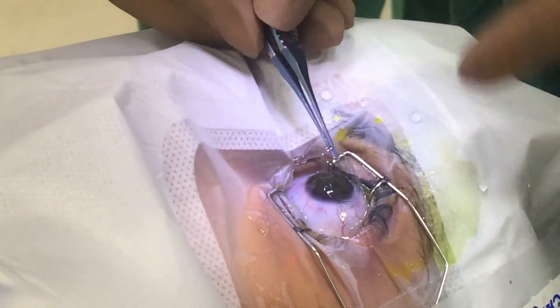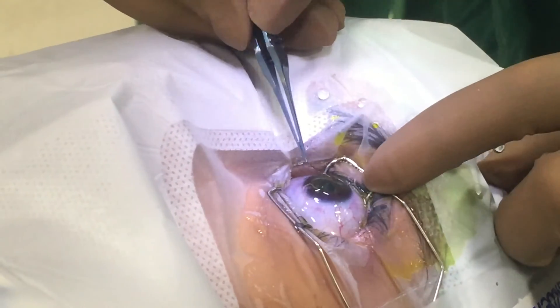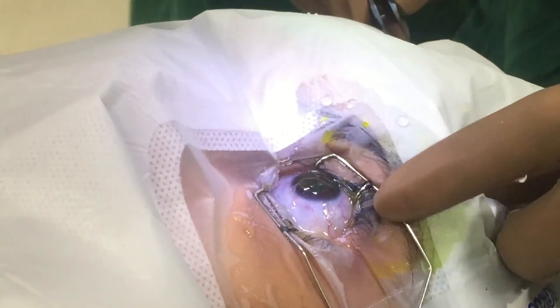For the epithelium to heal, we place a bandage contact lens over the eye, which allows the front surface of the cornea to heal. We also put an antibiotic eye drop. No additional bandage is required, and the patient can go home comfortably.